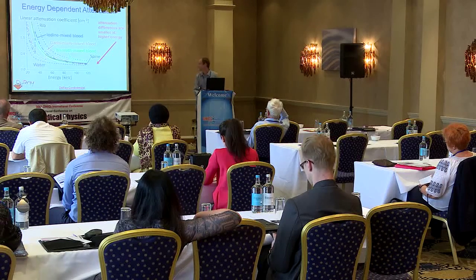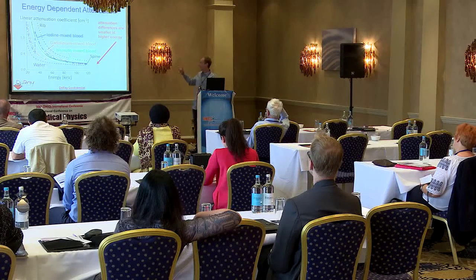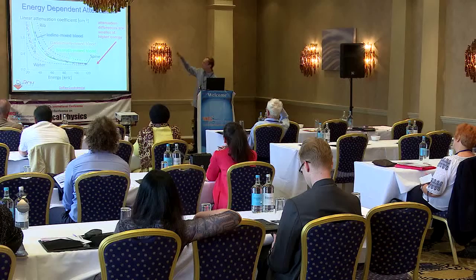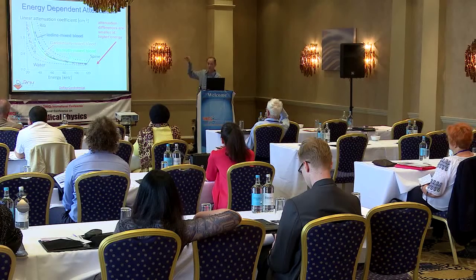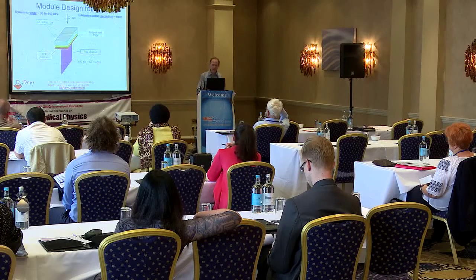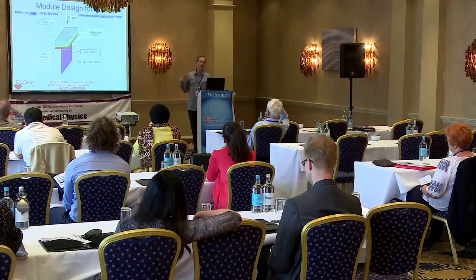One of the reasons is because the attenuation curves are energy dependent, as shown here. I show a graph here of iodine, gadolinium, and bismuth mixed blood, and you can see that if we were able to bin X-rays according to energy, then we could take advantage of the K-edge absorption and increase dramatically the contrast for these materials.